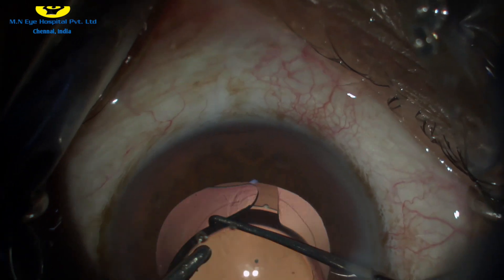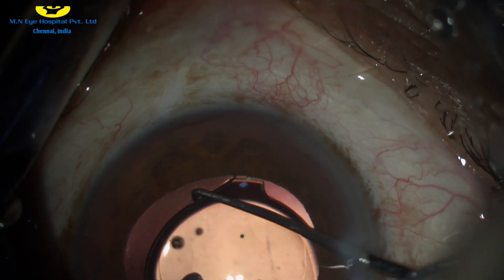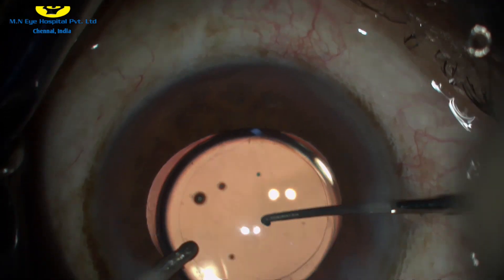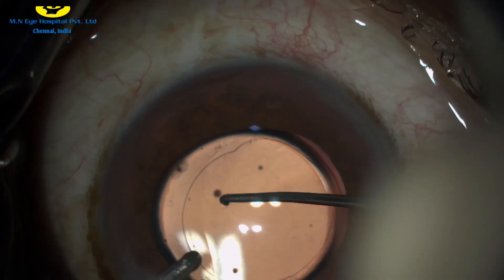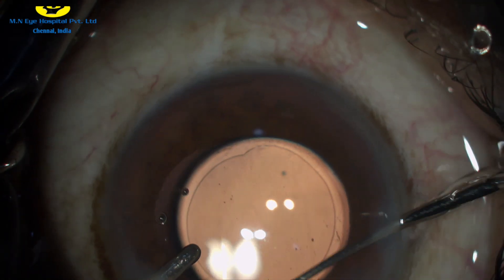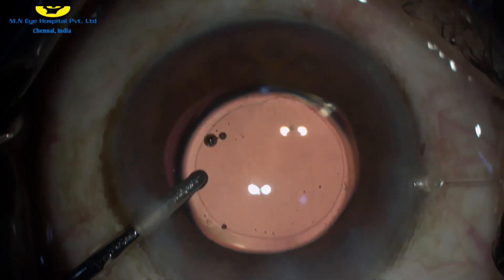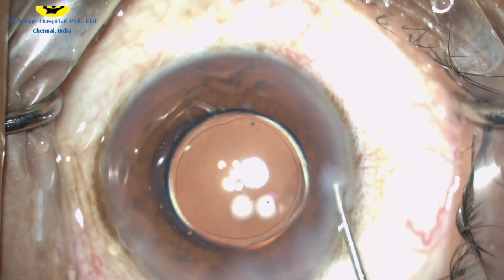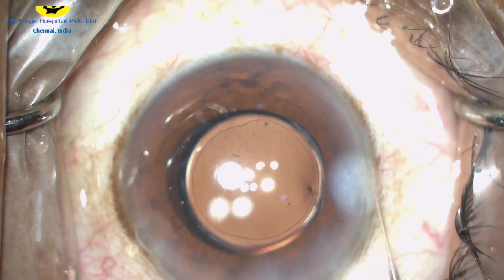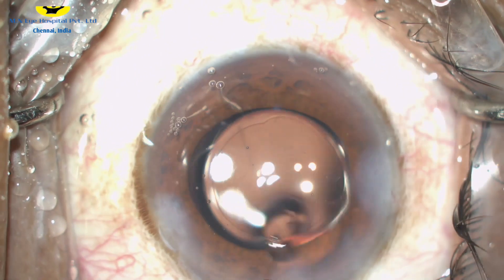This is the gap between the square edge of the lens. You can see that the intraocular lens is well centered and there is very good overlap of the rhexis margins over the intraocular lens. The side ports and the main incision are then finally hydrated and the case is closed.